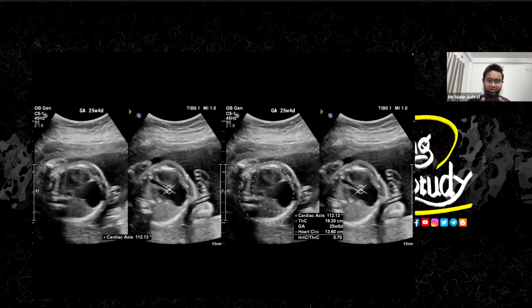So we have checked some measurements. Don't expect much better measurement because my machine can't trace the image. So hey, machine manufacturers, you should put some options to trace the images.